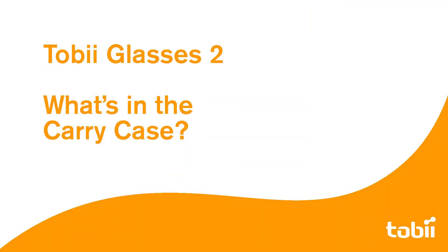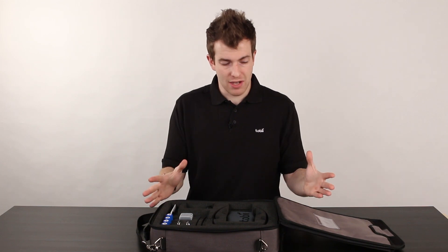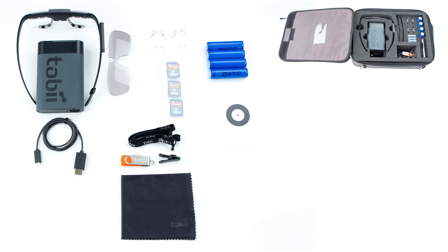First we're going to have a look at the carry case. As you can see there's a lot of stuff in here, so we'll zoom in so we can show it all to you a little bit easier. We have the head unit itself which comes with a clear plastic protective lens already attached. We also have a tinted lens in the case as well. This is the actual eye tracker with several sensors that track what the person wearing it is looking at. Always handle the head unit with care and keep it clean as it is a delicate measurement instrument.